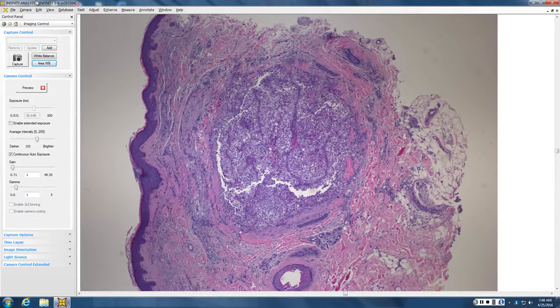Okay. So things characteristic for renal, it tends to be usually a single round nodule. So a lot of the things we see like breast tend to spread out and infiltrate between collagen. Renal tends to be a big round nodule, and that nodule is made up of tubules that have glycogen, so the cells appear clear, and then they are very bloody.